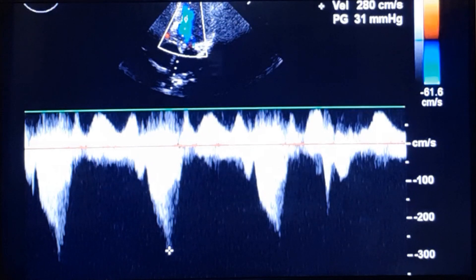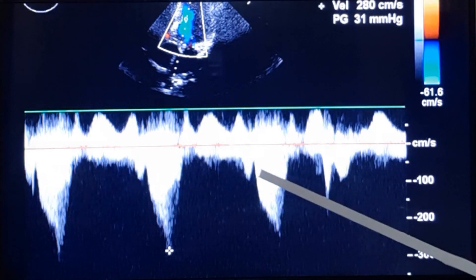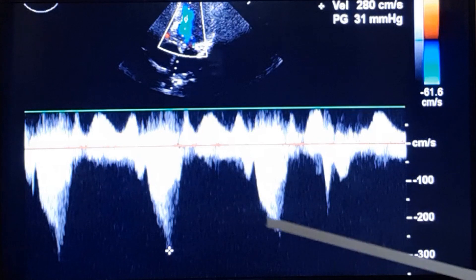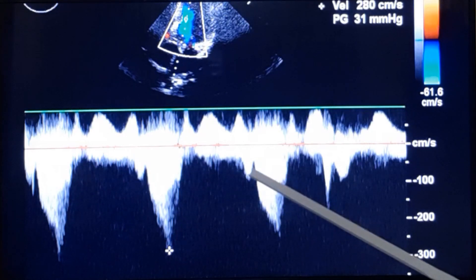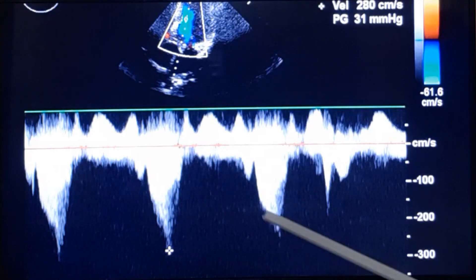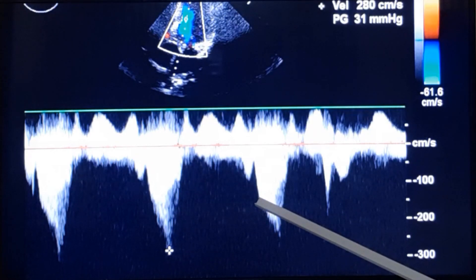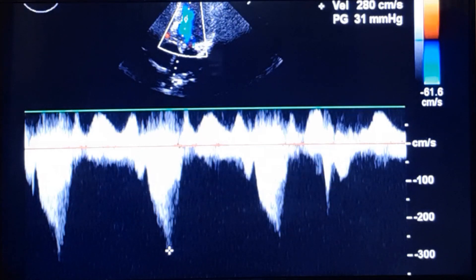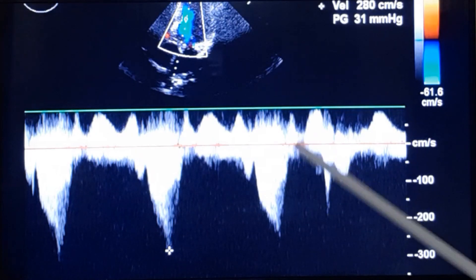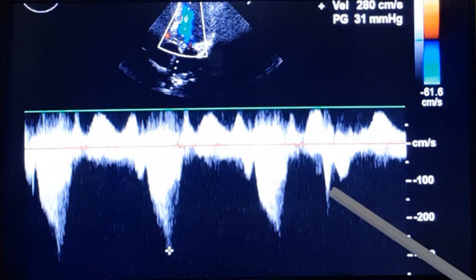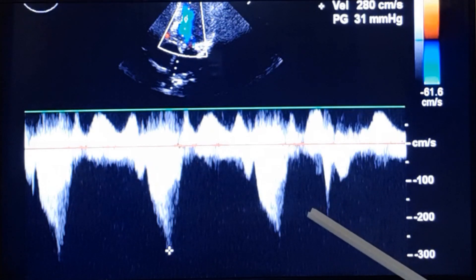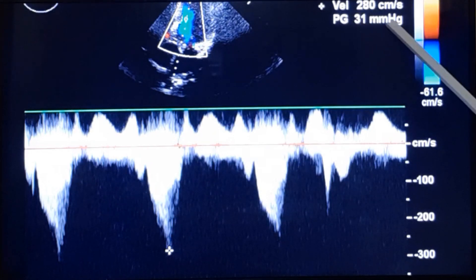This is a Doppler echocardiogram from another case illustrating the typical dagger-shaped or sickle-shaped jet in hypertrophic obstructive cardiomyopathy. In valvar obstruction it would be a tongue-shaped symmetrical jet. Here the initial gradient is less and later the gradient peaks up — that is the usual feature in HOCM. This gradient is only 31, but can increase further with provocative maneuvers.